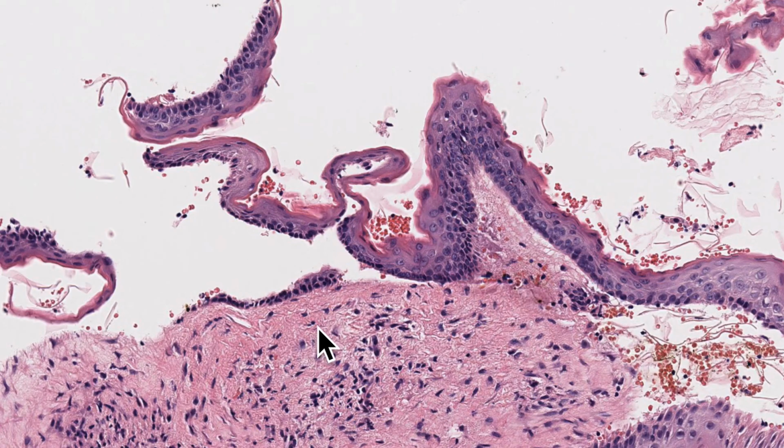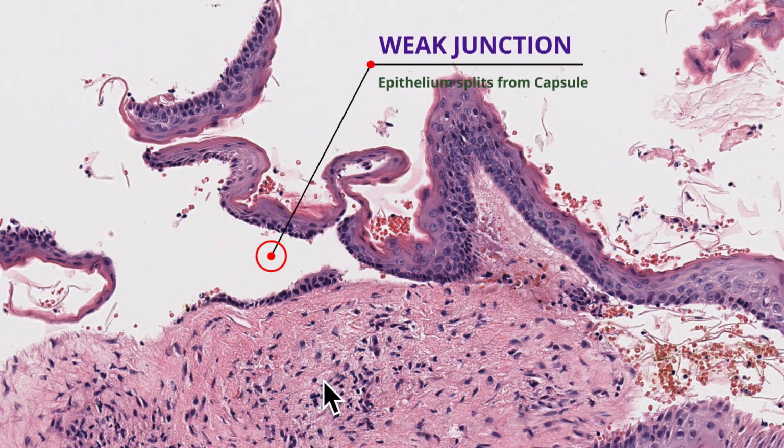One more important feature of odontogenic keratocyst lies within the epithelial lining. The stratified squamous parakeratinized epithelial lining of odontogenic keratocyst is typically folded. As I told, it is corrugated, the surface is thrown into folds. And one important feature is the epithelial lining tends to easily split from the underlying connective tissue.